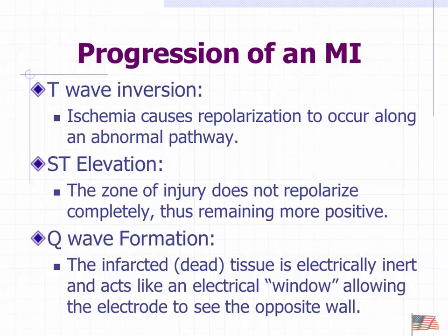What do I want you to know? I want you to know how to identify ischemia, and injury, and infarction. Ischemia, ST depression. Injury, ST elevation.